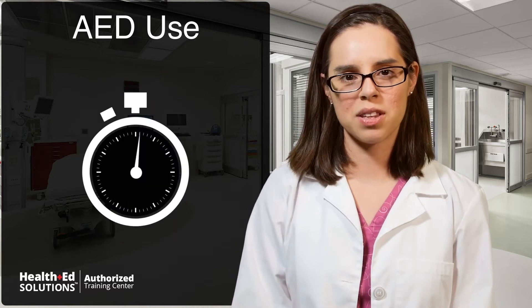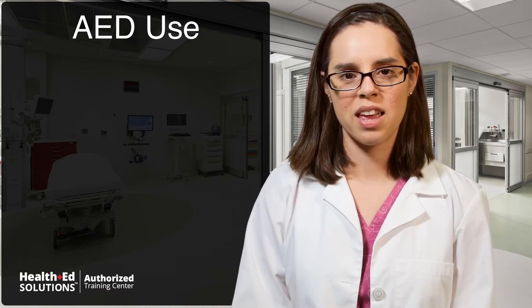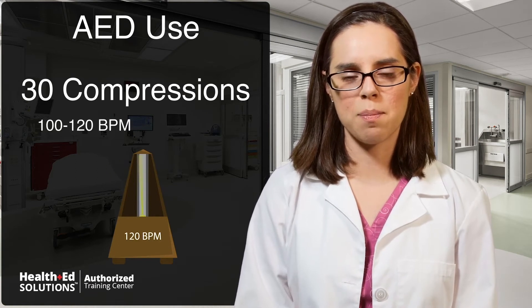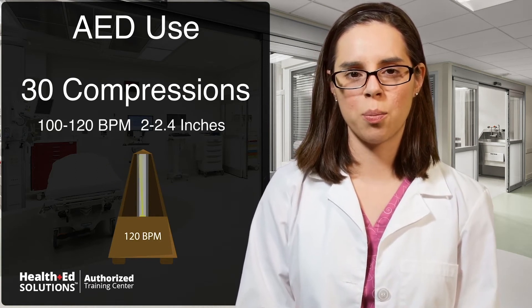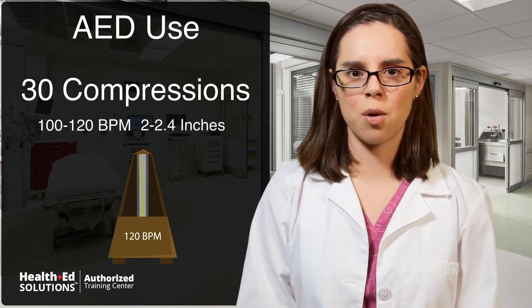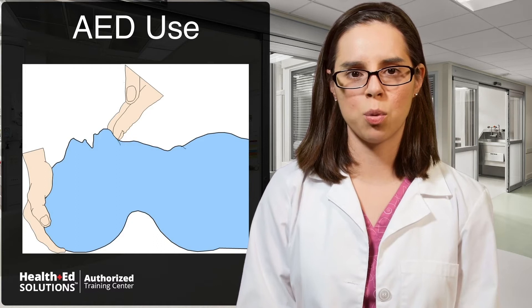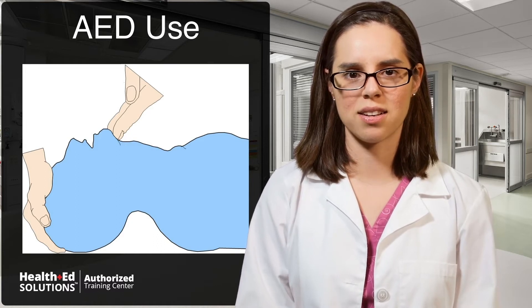Begin 2 minutes of CPR or about 5 cycles. Give 30 compressions over the pads at a rate of 100-120 beats per minute and 2 to 2.4 inches deep. Next, using the rescue mask, tilt the head and lift the chin and deliver two rescue breaths, looking for the rise and fall of the chest.